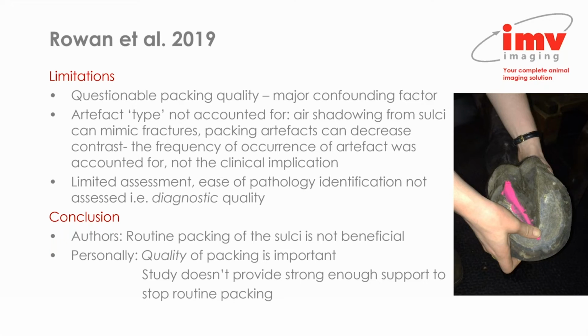So in conclusions, the authors concluded that routine packing of the sulci is not beneficial. However, I would disagree, and I think that this study more shows that the quality of packing is potentially important, and that is what I believe to be true. The study doesn't provide strong enough evidence to support our stopping routine packing at this stage.